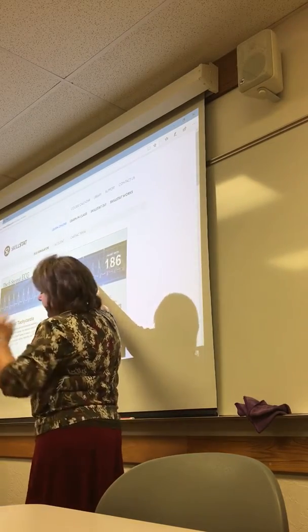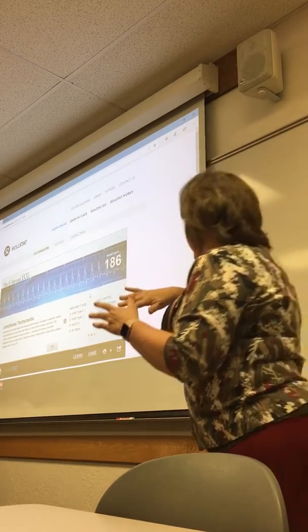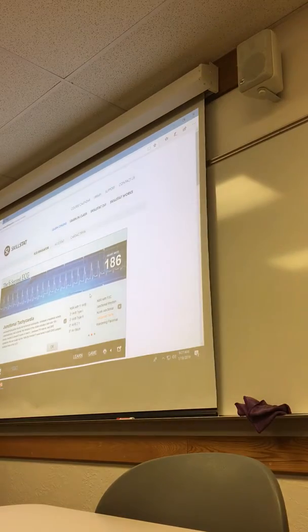The reason this one is not is because you see that first impulse, it starts to come down. I'll slow it down here. If that first QRS came down here, it would be normal, but it hits some kind of necrosis or something and it goes around, and so we get this bifurcation in it. So if I've had a previous heart attack and it's wiped out this area, then the signal has to go around it. And what that would look like on an EKG is something like this, okay?